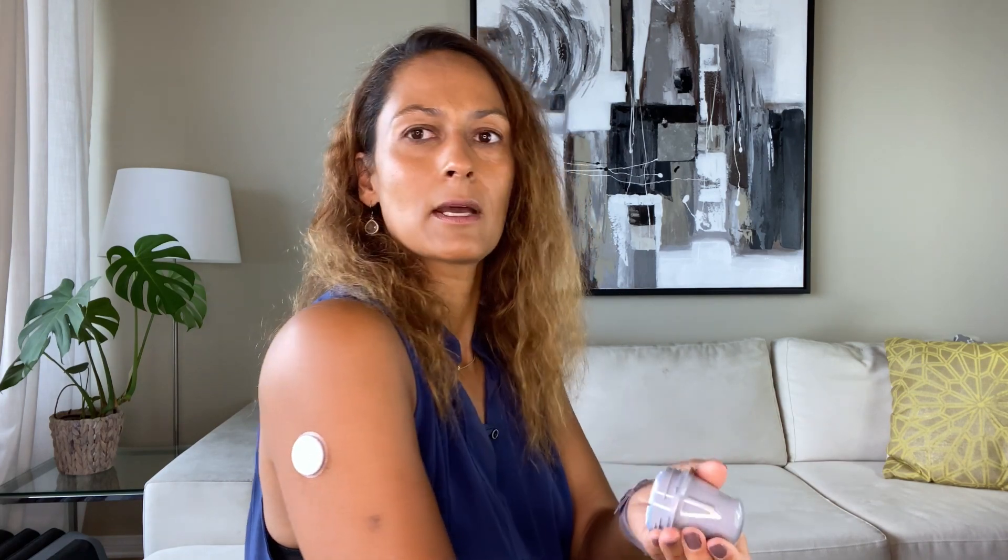Once your arm is dry, you're ready to apply the sensor. Hold onto the gray part and simply press it against the skin. I haven't tried the Libre 2 before, so this is new to me as well. Clean the back of the arm, put it up against the skin, and push down. There you go — that was super easy. Then throw the applicator away, and make sure the sensor is actually sticking to the skin.